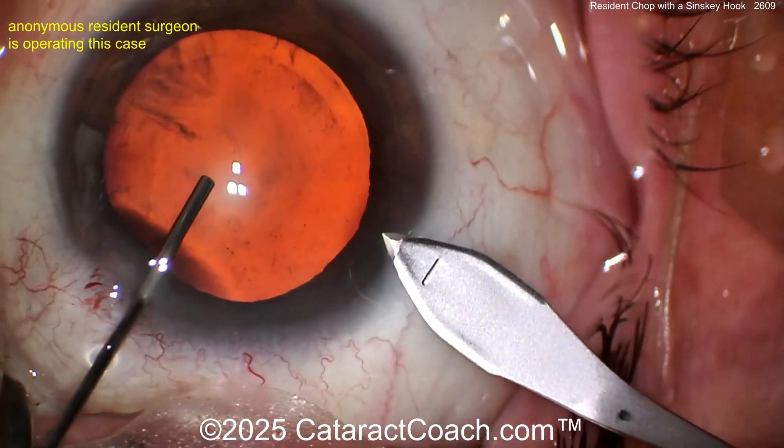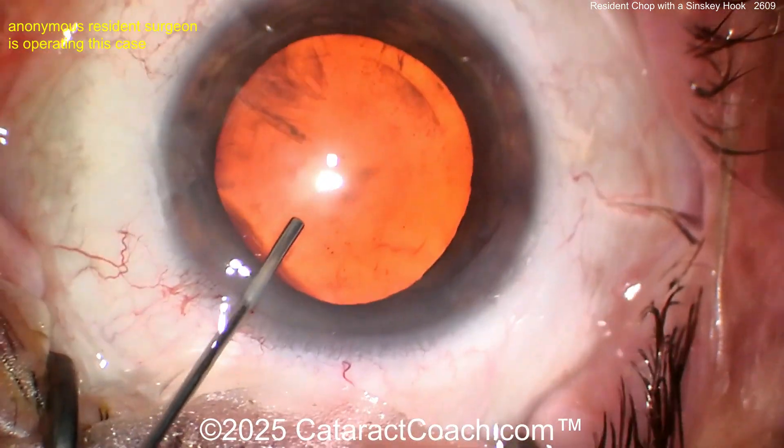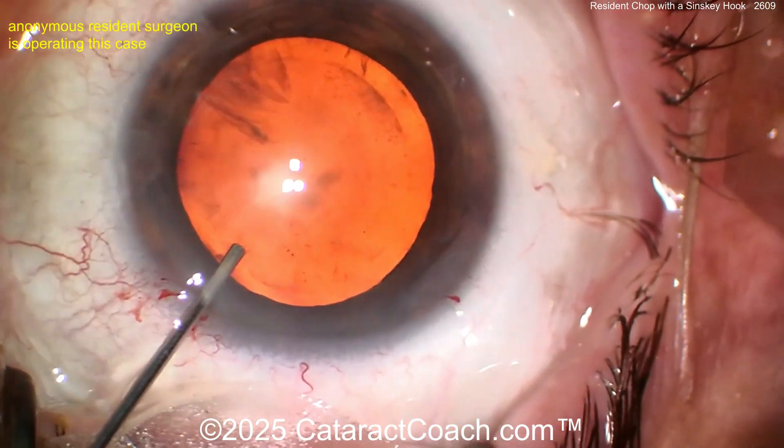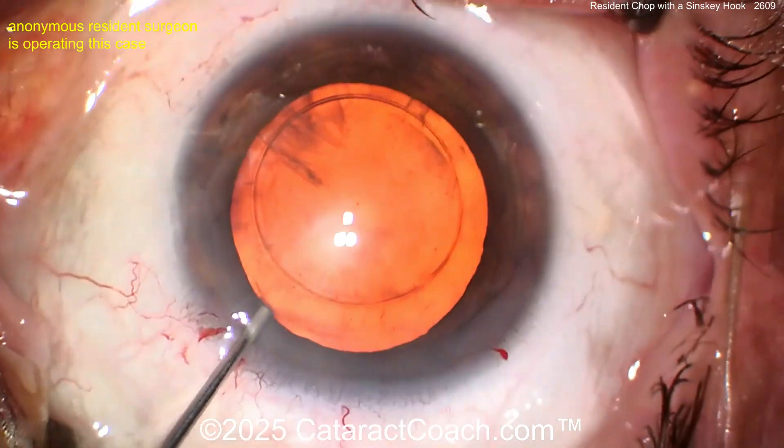Here's the viscoelastic going inside the eye — good dilation, not too dense of a cataract. Fixating the eye with the cannula there. Here comes the main incision; it looks tolerable. Did you hit any limbal vessels? Maybe barely. The incision is kind of short.